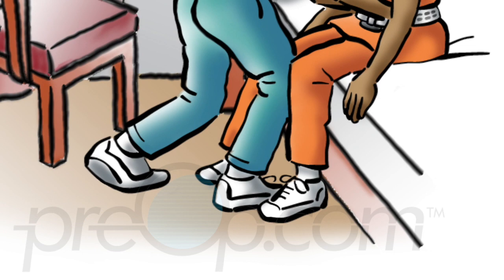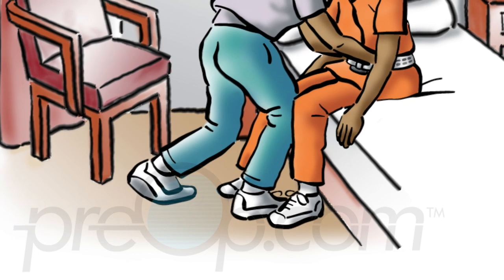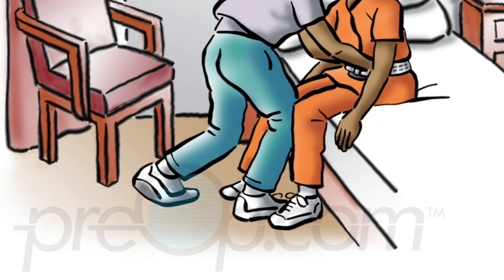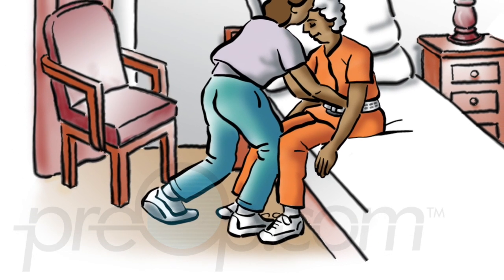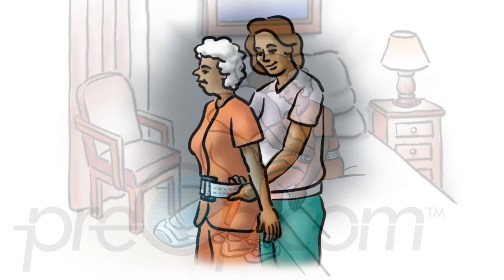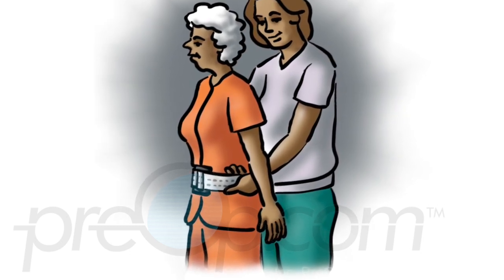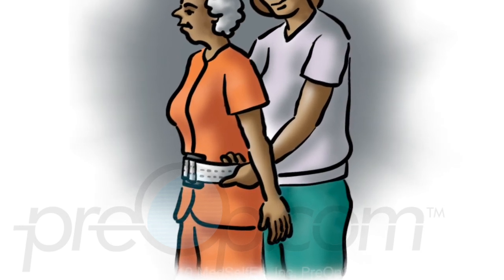Position feet about 12 inches apart and both hands palm-down on the mattress at the side. Place one of your legs between the patient's legs and slightly bend your knees. Grasp the transfer belt from underneath with one hand on either side, several inches away from the buckle. Have the patient lean forward and on the count of three push off the bed with feet and hands to stand up. Use the belt as a support and do not pull the patient up with it. Allow the patient to stand still until comfortable.